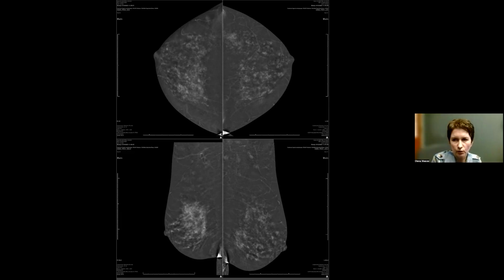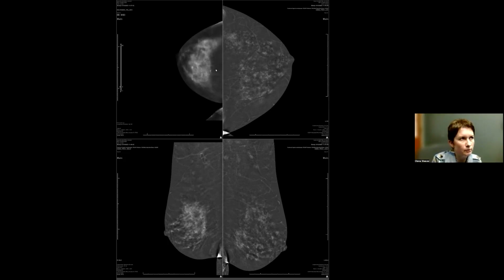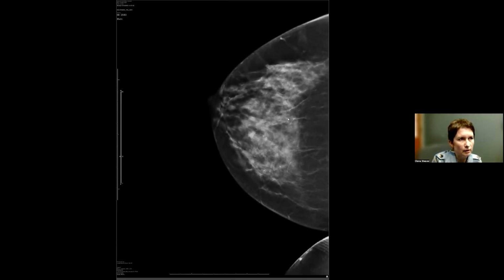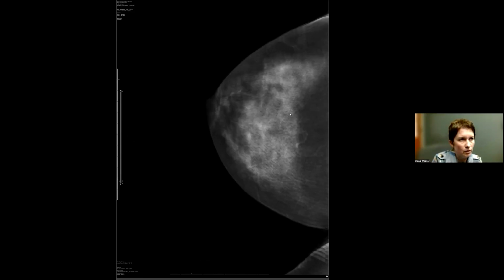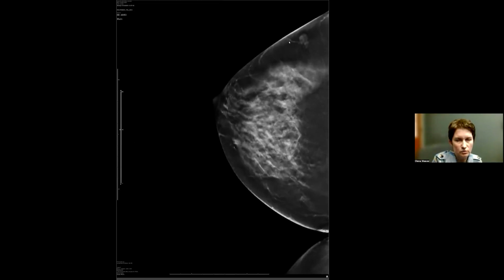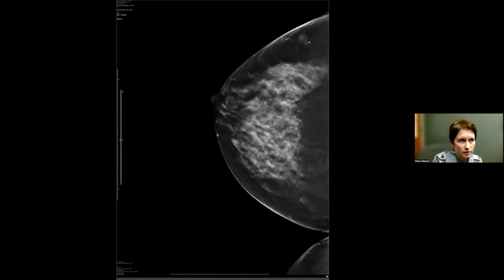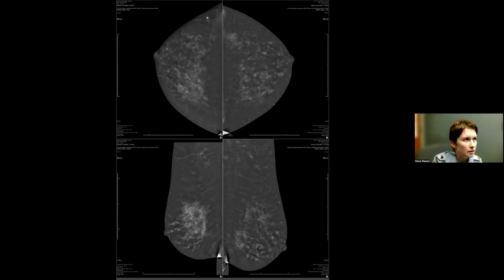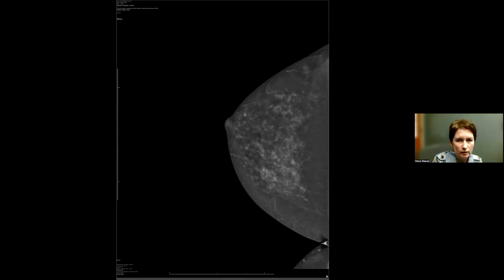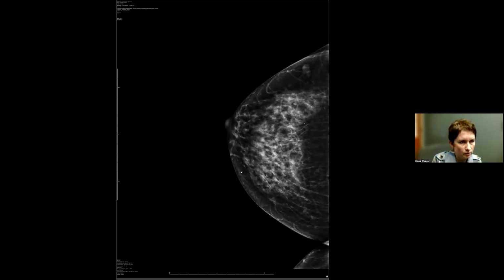So this is a case where we did have DBT, digital breast tomosynthesis, and just like with low energy and recombined images, you can toggle with your DBT. So you can actually see exactly what's under your enhancing findings. Just like in this case, in the outer breast, we see it's the classic lymph nodes with fatty hila. And if you bring back your recombined image, you will see that there is a little bit of enhancement there. And there is a mass on the lower energy images.